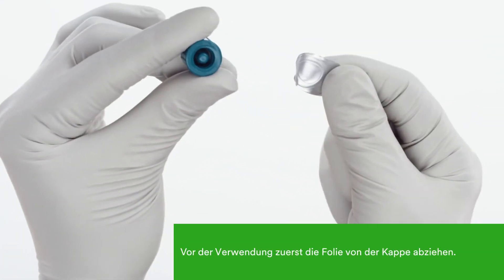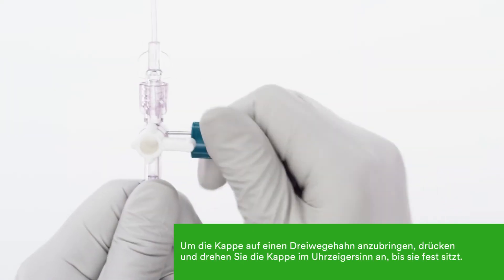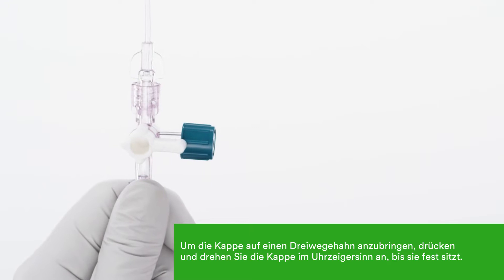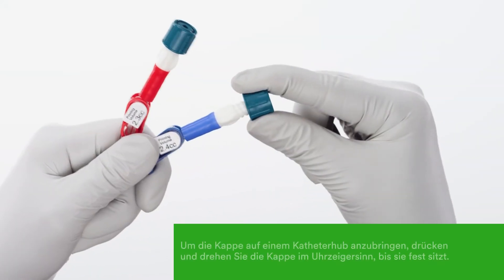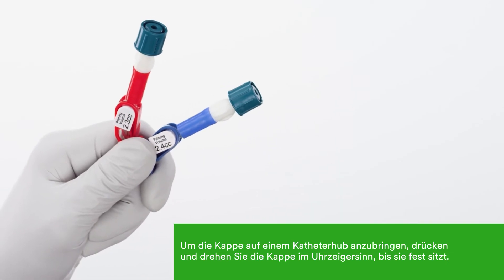To use the cap, peel it from the foil. To attach the cap to a stopcock, push and twist clockwise into place until tightly connected. To attach the cap to a catheter hub, push and twist clockwise into place until tightly connected.